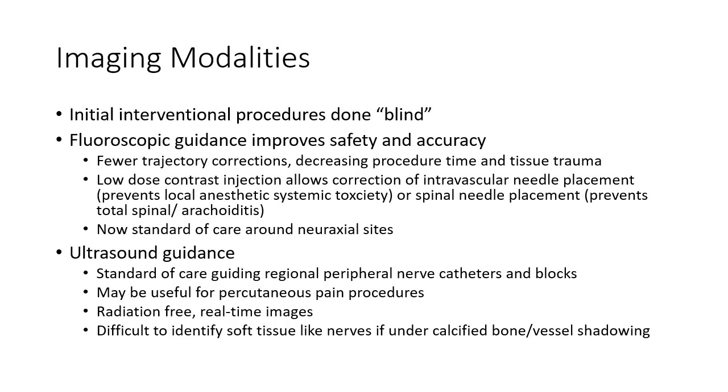When interventional procedures were first introduced, epidural steroid injections were performed using a blind technique. Even in the hands of a skilled and experienced proceduralist, inaccurate needle placement occurred in 25 to 30% of blind injections. The ability to visualize the target allows placement of the introducer needle with fewer trajectory corrections, reducing procedure time and tissue trauma.